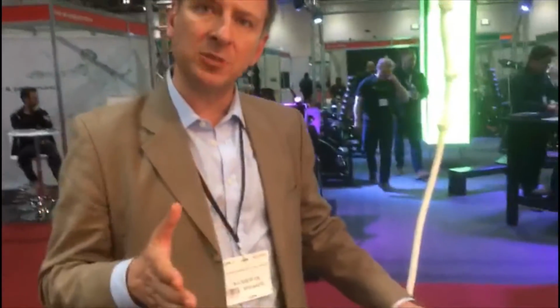And if I'm coming in with a disc problem or back pain, how long would you use a laser on me, or does it depend? We work with fibromyalgia patients, and with sciatic and fibromyalgia, that might be 12 sessions. With someone who's had a disc protrusion, or someone who's had back surgery, again, that might be 12 sessions.